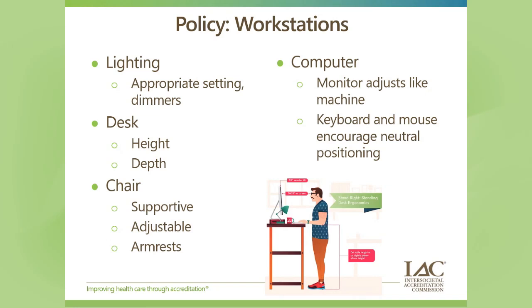And then setting up your computer in the way that you would your ultrasound system so that the monitor adjusts. Most of our monitors adjust up and down, or there are great little elevation platforms that you or your facility can invest in, so that if your monitor height is not high enough, you can elevate it further. There are arms that you can attach monitors and computers with. So there are a lot of additional accessories that can ensure that monitor height is appropriate for all users for that workstation.